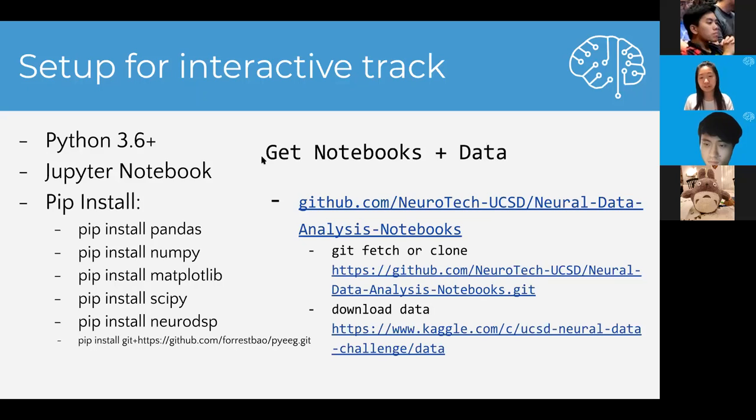For fitting in the raw EEG data, those methods do exist if you have neural networks and things like that. I think the deep learning workshop from DS3 could potentially go over that. But usually CNNs and things that have the ability to take in all the pixels of an image would be able to do something with the actual raw EEG data. So those two methods are used, depending on your model.